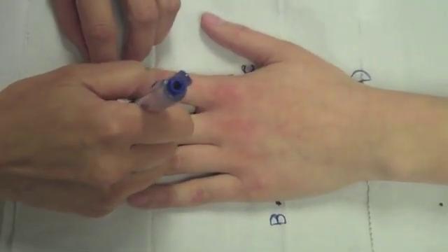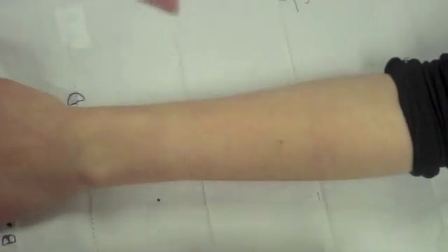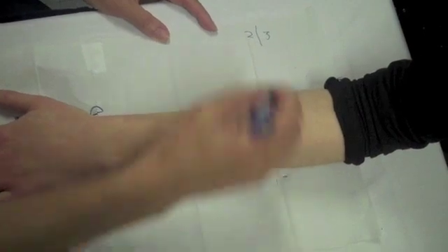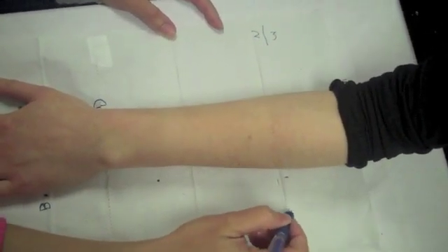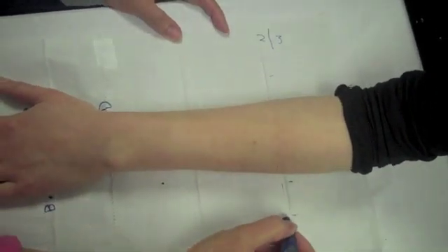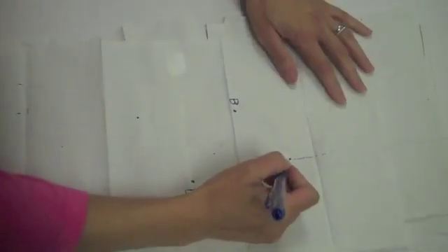Mark a dotted line at the second webspace. Then mark approximately two-thirds down the forearm. Make another set of marks about an inch and a half from the previous marks so that the forearm trough will come up about an inch and a half of the forearm. Extend the dotted line to point D.